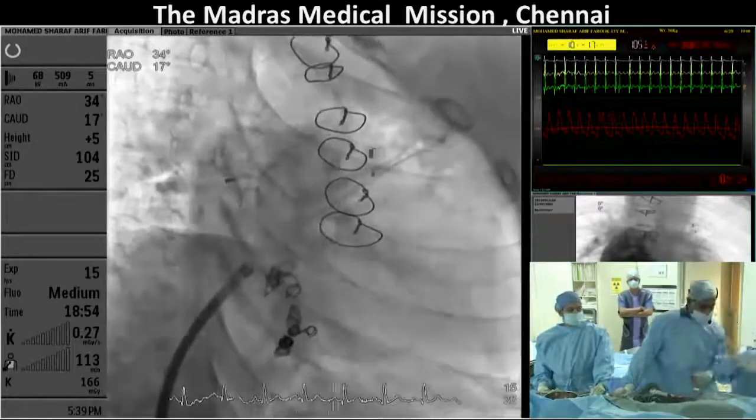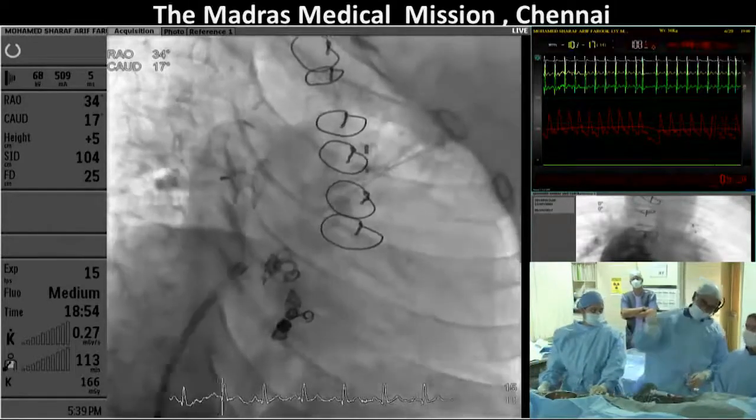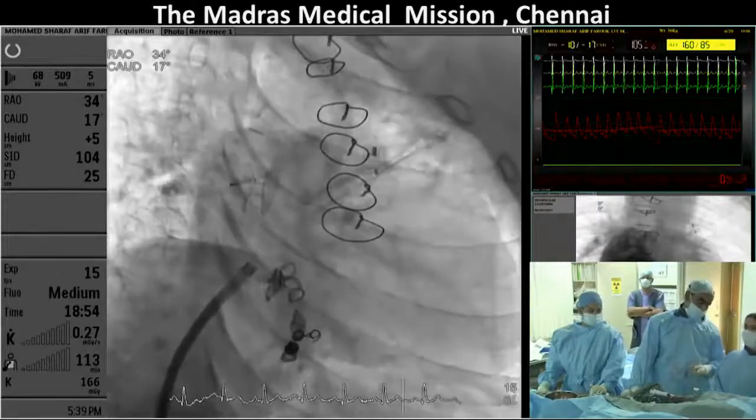I think it's harder to do with a wire mesh device. It's much easier to do with a device that closes mostly with fabric. Definitely a very successful technique. But I'm not sure they're available anymore. I don't want to make it very small originally. Let it endothelialize slowly.